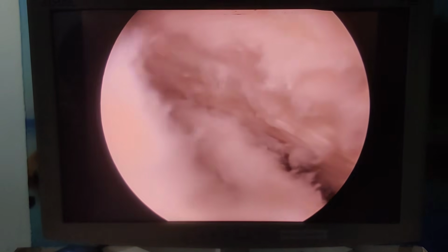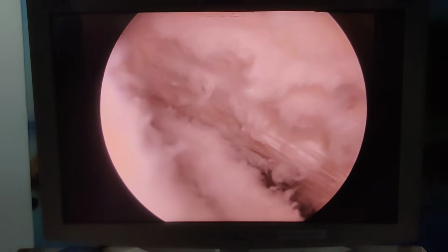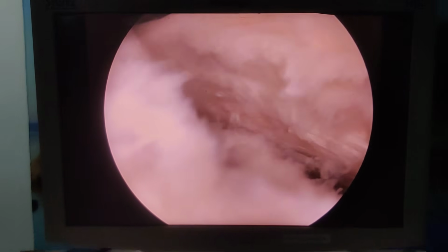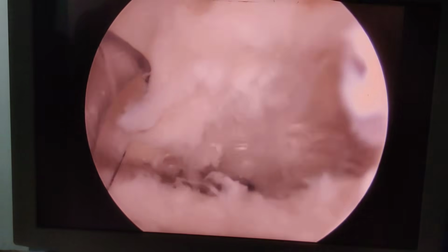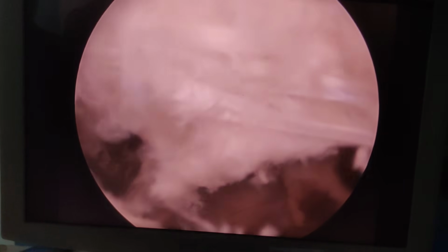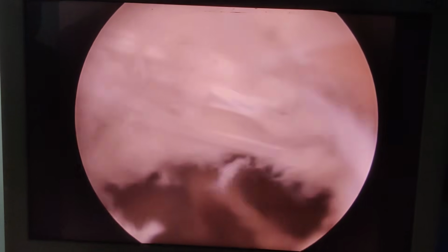The idea is, this is a 30-degree scope. If I had shown the same thing from a 70-degree scope, you would have seen much better. But anyway, I just want you to have an idea, so I think you have got this idea. So I'll continue to work, and then I will join you back. Now normally I work from the anterolateral portal. Now I am in the anteromedial portal. My scope is in the anteromedial portal. That gave me some more access towards the lateral aspect, and I have shaved that.